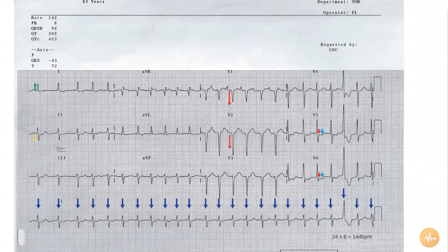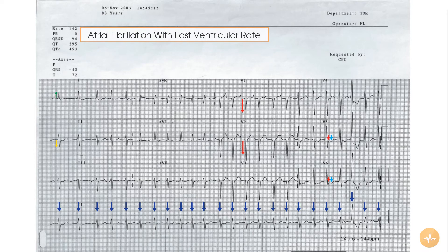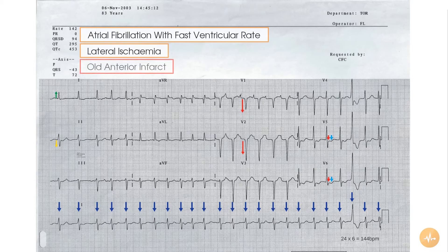In summary, this 12-lead ECG, recorded from a patient complaining of both chest pain and palpitations, reveals them to be in atrial fibrillation with a fast ventricular response, lateral evidence of ischemia, and anterior evidence of a previous full thickness myocardial infarction.